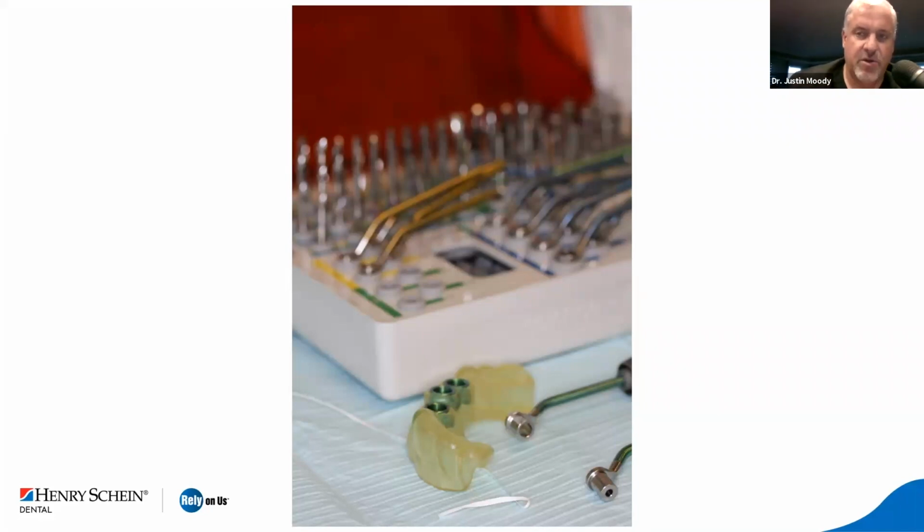I can't tell you how important it is, for all of the things that we just mentioned, that you only use SprintRay resins with the SprintRay machine. They are calibrated and tested for that machine and those settings. So you don't want to try to skimp by using a cheaper resin, because you only would want to skimp one time and have the implant go in a position that you don't want it to be.